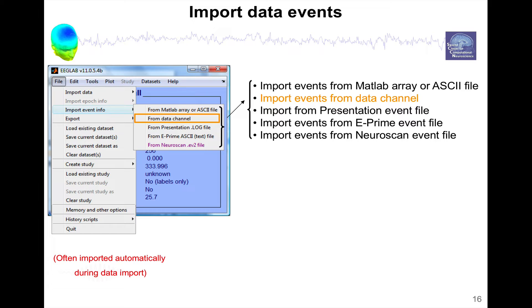What EEGLAB will do is import these events and then calculate possible discrepancy in the sampling rate in the order of 0.1% and then align these events as best as possible. Here we'll just see the simple example of importing from a data channel.